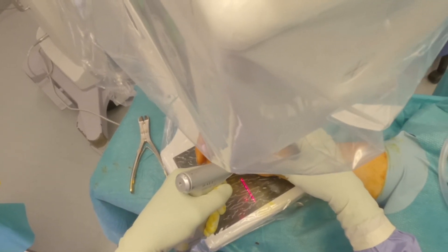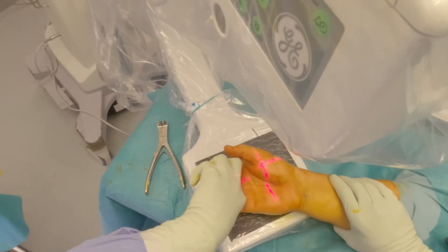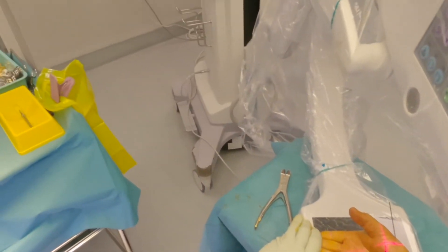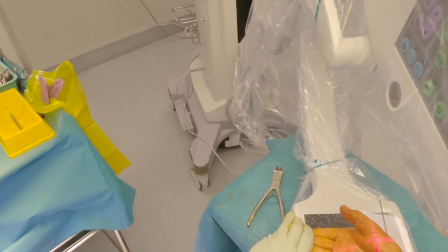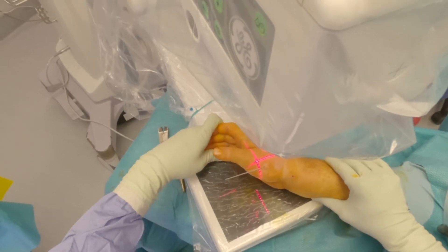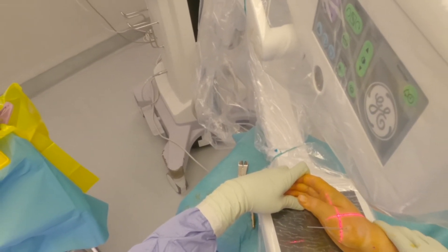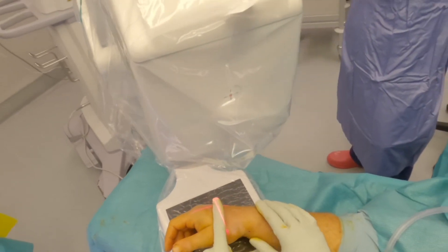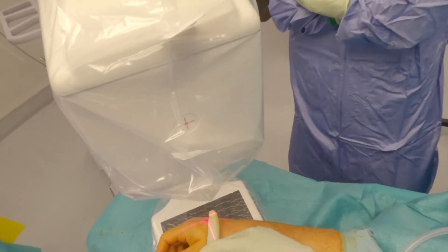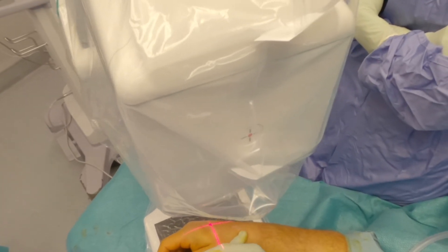Check x-rays confirmed satisfactory wire placement and joint congruity. An axial load is applied to the thumb to check for stability before dressing with Jelonet, gauze, wool, and a thumb spica plaster. Wires are removed under local anaesthetic in the clinic at 4 to 6 weeks post-op. Hand therapy is commenced at 2 weeks for IP joint range of motion, and loading of the thumb is avoided until 6 weeks post-op.